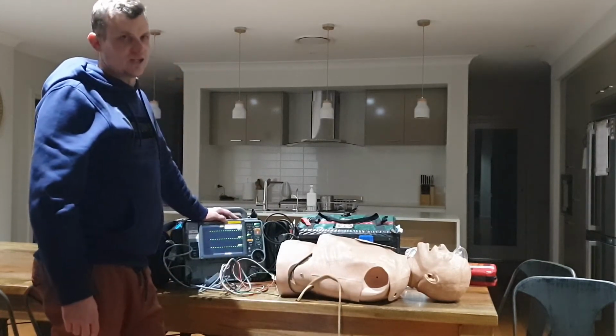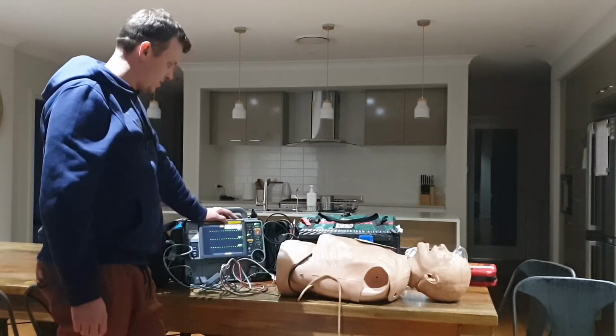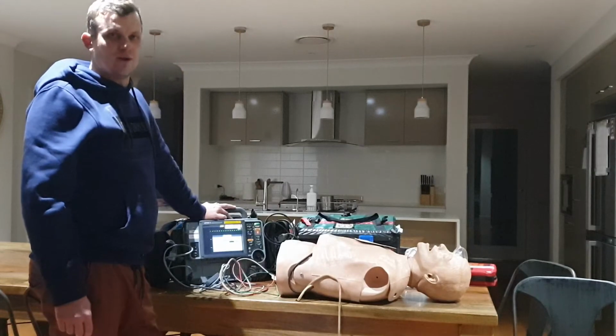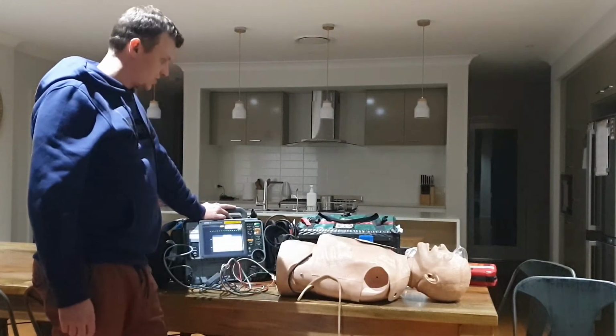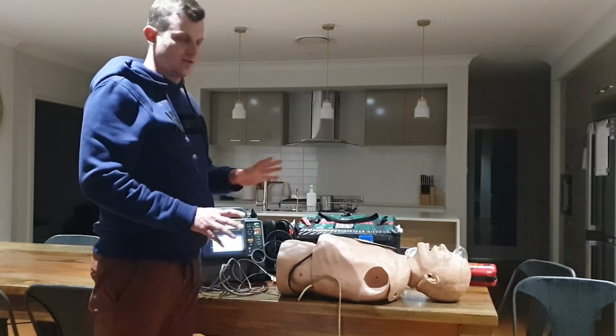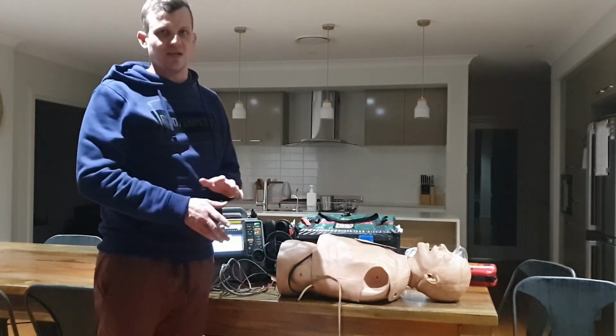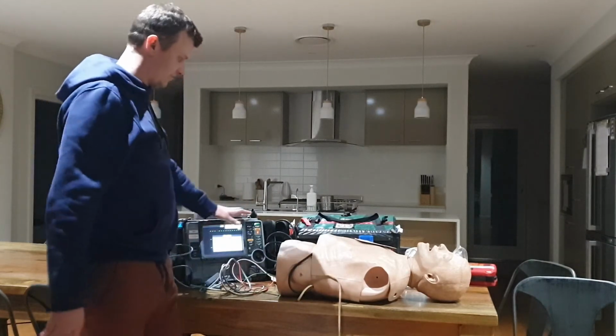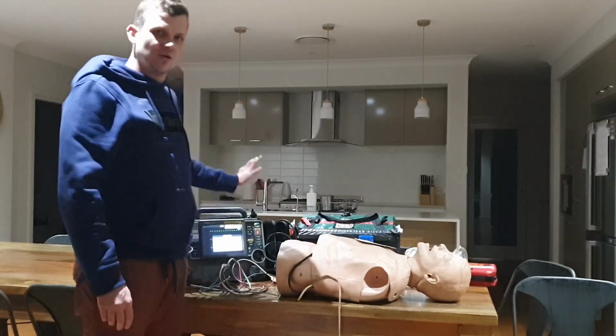At the moment it says it can't charge in sync mode. So what I might do is I'll just pretend it's charging up at the moment. So that's charged, it's synced to the R waves, and then you want to make sure everyone's clear. The patient has received their pre-procedure analgesia and sedation. They've got oxygen therapy running, it's synchronized to the R waves, and you want to deliver your first shock.